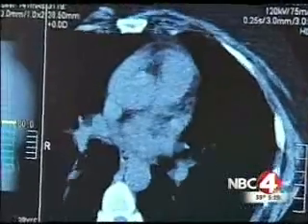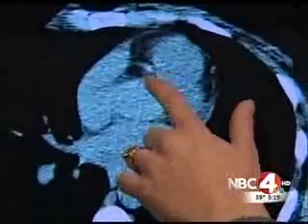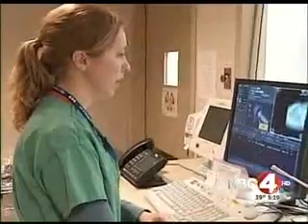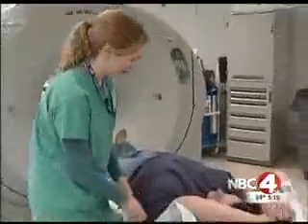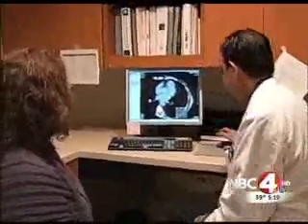They're looking for little pink dots. Dots would indicate plaque buildup. Right here is her right coronary artery, and there's a little speck of pink right in that particular artery. They found something. In less than 10 minutes, the calcium score is done. Okay, if you want to go ahead and bring your arms down by your sides. Dr. Grewal goes over the results with her immediately.